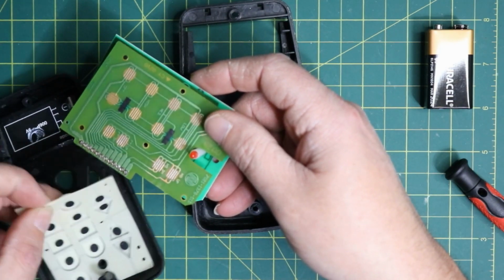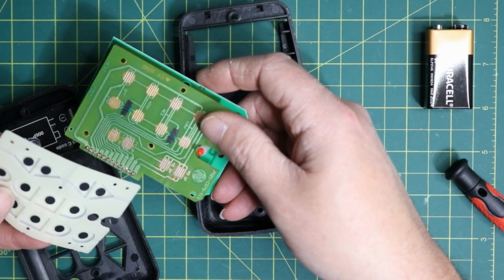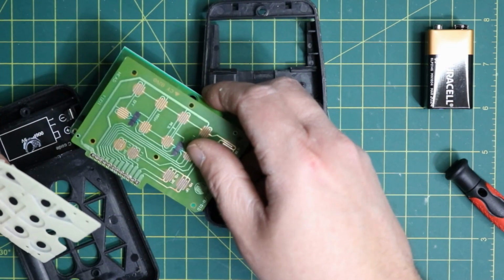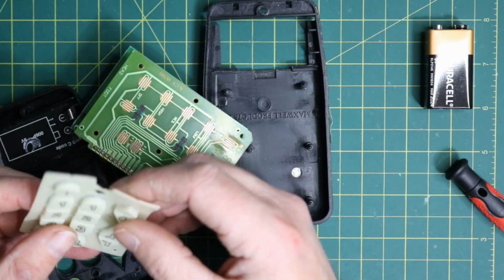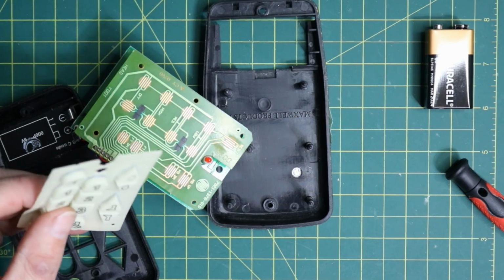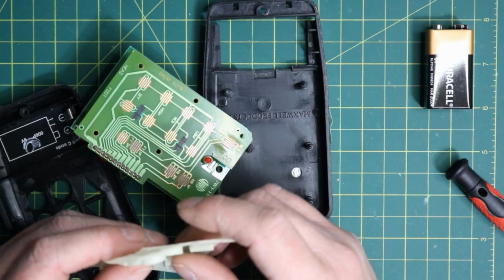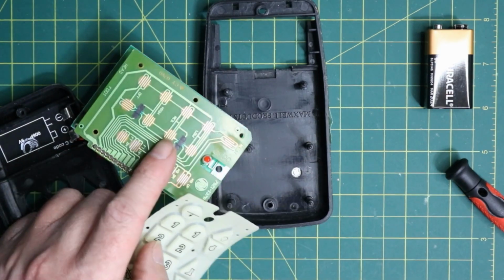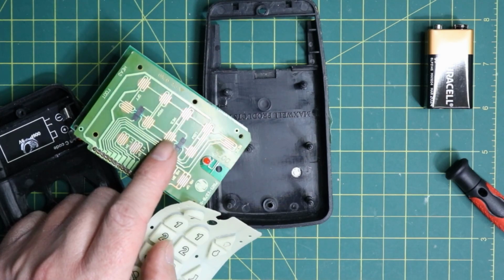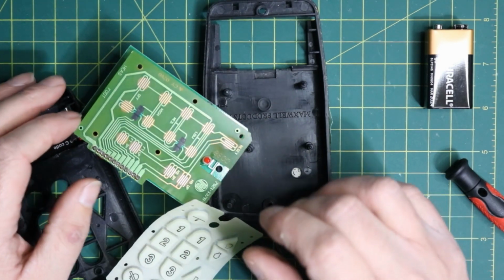So let's get this guy cleaned up, and the inlay here, and then I will, like I said, solder that up and give it back to them, and they can test it out and check it out. So I do have some IPA, and I'm using 99% to clean this. So let's go ahead and first inspect the inlay here.